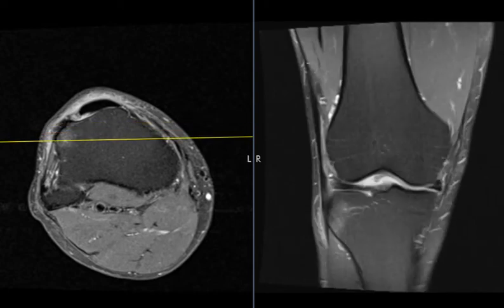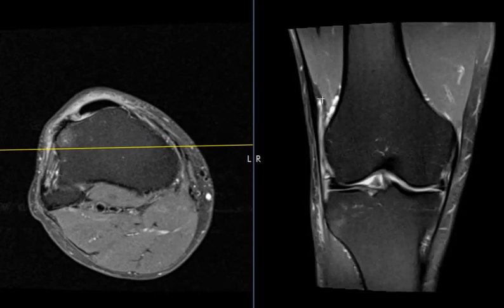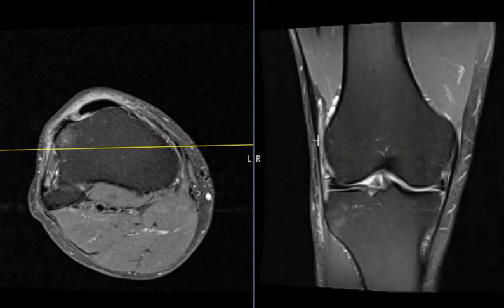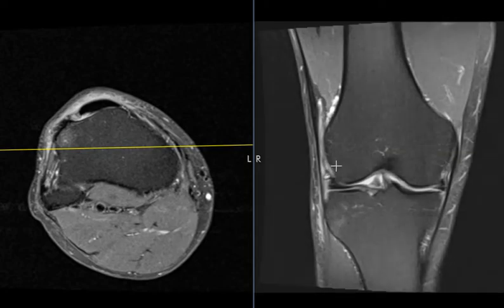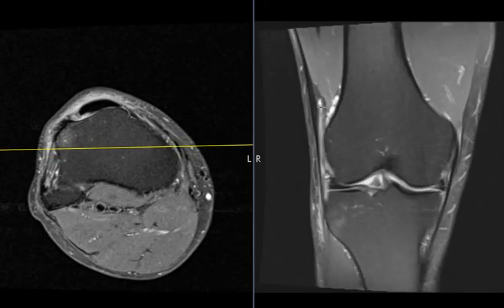This is the iliotibial band coming down, and the iliotibial band is going to come down here and attach below the knee on Gerdy's tubercle. Right here we see this band of bright signal — a vertical area of increased signal. This is between the ITB and the femur, and this is inflammation. So this is related to iliotibial band friction syndrome from jogging.